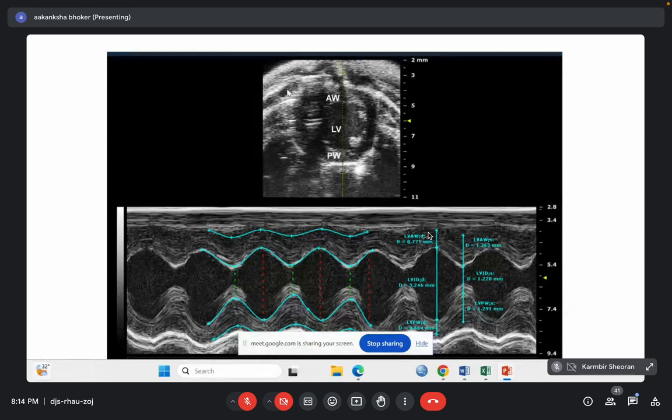So now it has got nothing to do with this frame and nothing to do with this frame. Only the line of interest, where we have placed the M mode cursor, all the points on it, their movement will be depicted in the M mode. So suppose this is the septal wall. This movement is being traced here. Okay. Below is the chamber, the posterior wall is here. This is the pericardium. Pericardial movement is being shown. So all this is the motion mode.